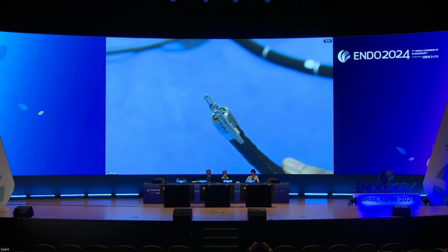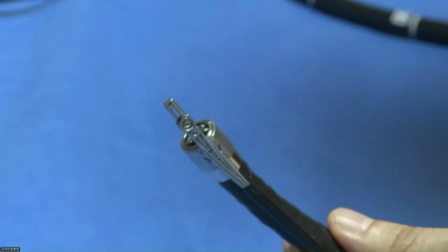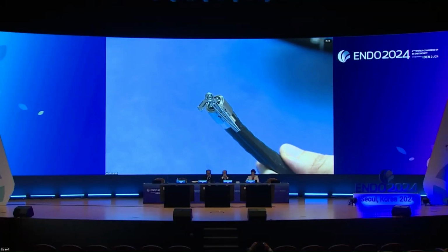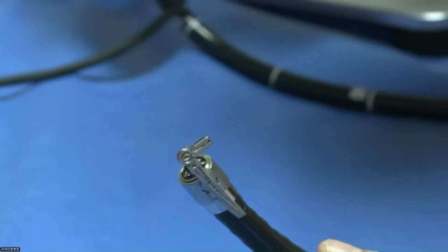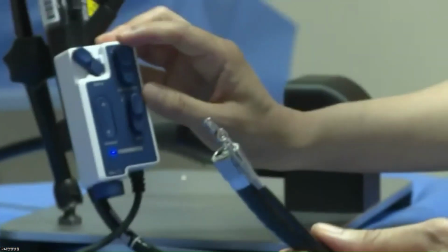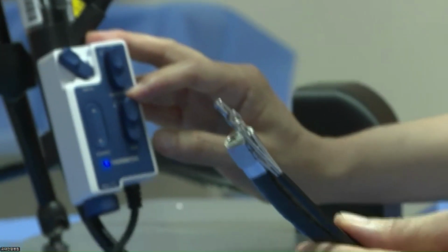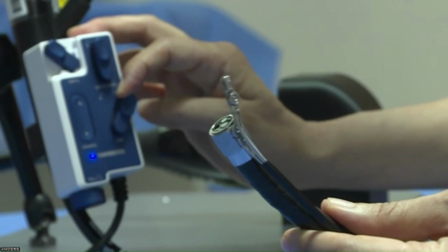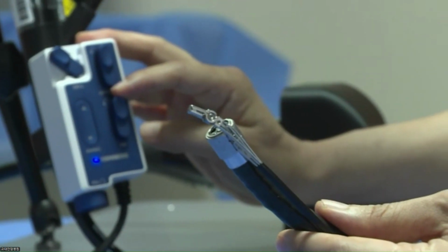Then the next lever controls the wrist. So the wrist goes this side 90 degrees, and the other side 90 degrees. A total of 180 degrees can be gained by this device. The next lever controls the arm, 90 degrees up and 90 degrees down. So you can check the normal movement.